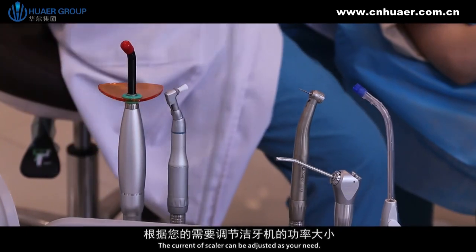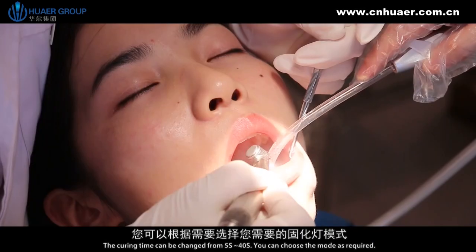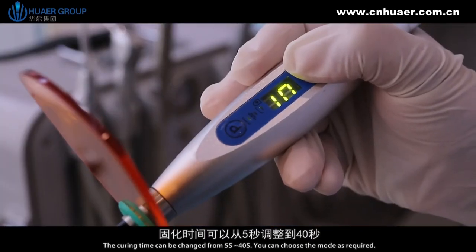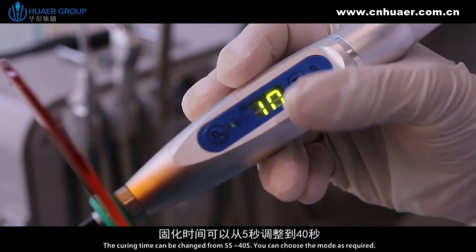The current of the scaler can be adjusted as needed. The curing time can be changed from 5 seconds to 40 seconds, and you can choose the mode as required.